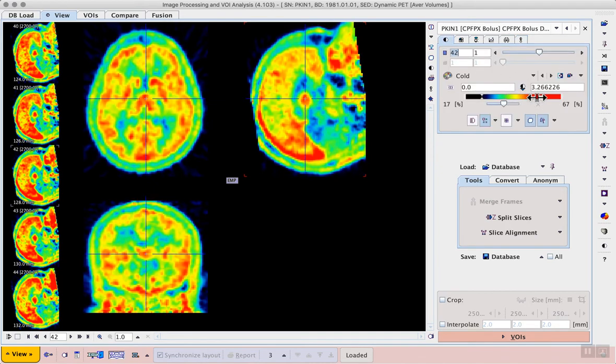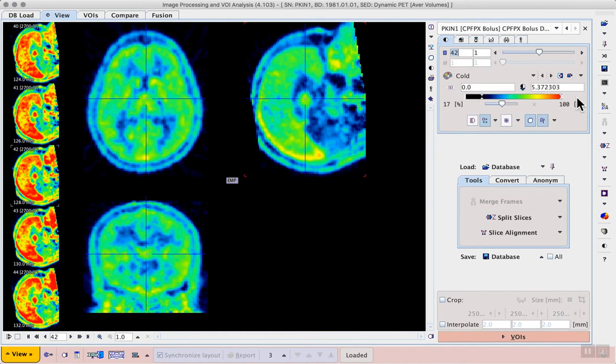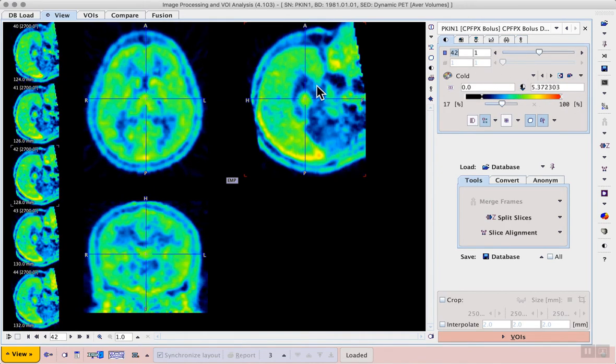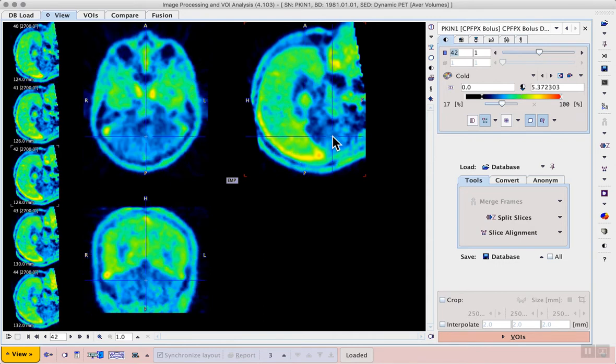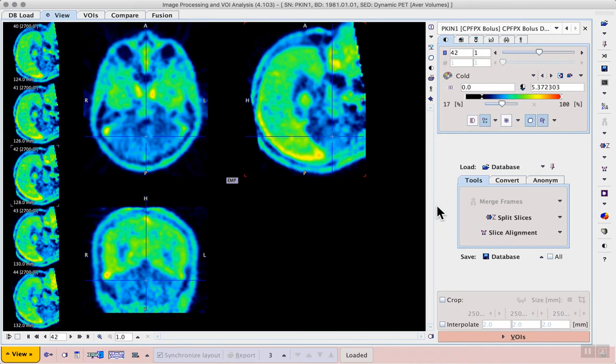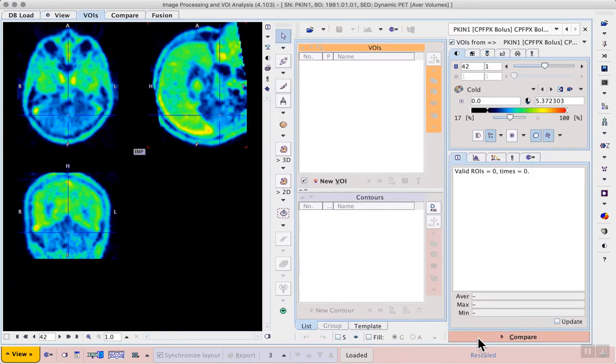Again we can adjust the upper threshold. We see that the average has resulted in a clearer picture of the tracer distribution throughout the cortex with a very low concentration in the cerebellum. Next we proceed to the VOIs page.